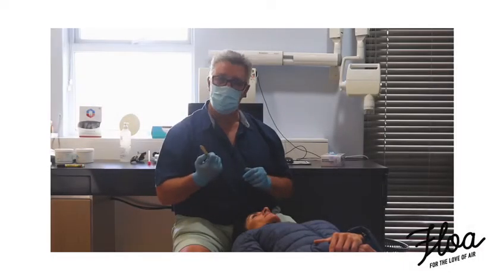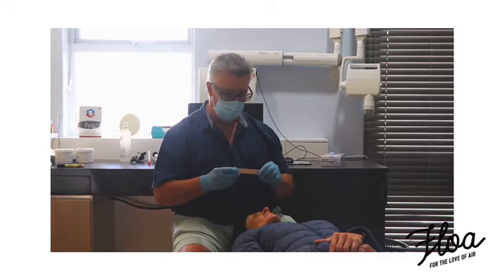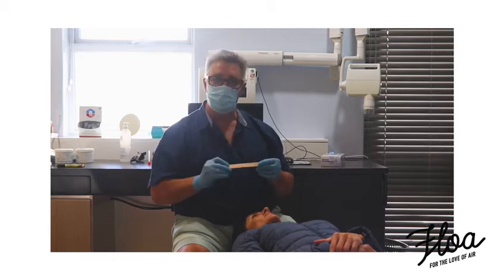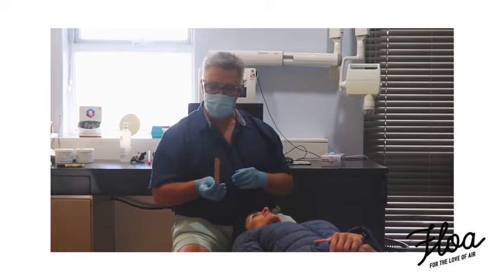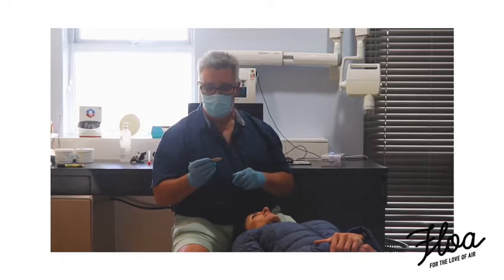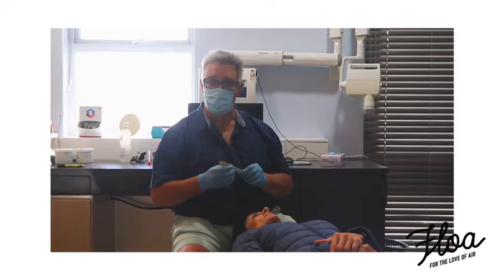I'm Davy Schlebusch. I'm going to show you how I do a bite for the Flowware appliance. I use little tongue depressors — they're cheap, they're easy to get hold of, and by using sound to find the optimal position for the Flowware, the optimal protrusive position, you don't need all the other fancy little ratchets and gimmicks.